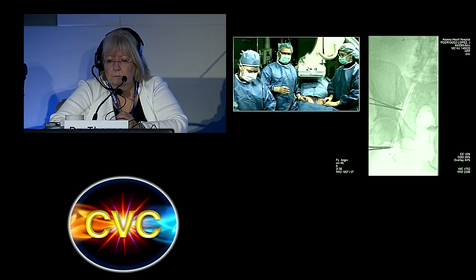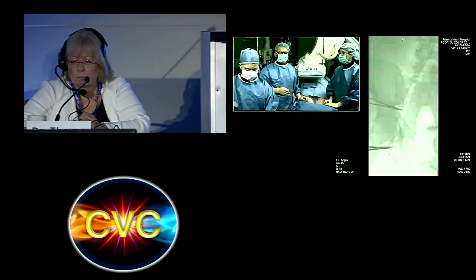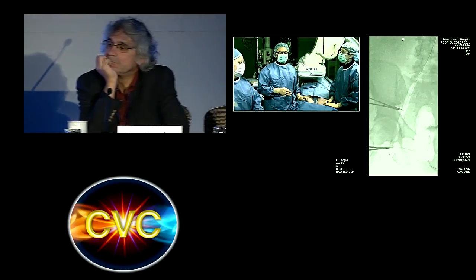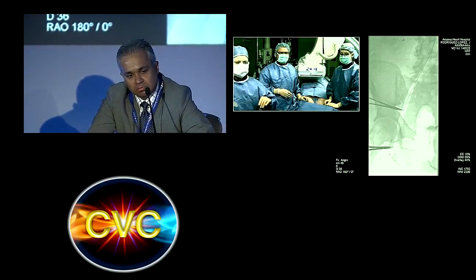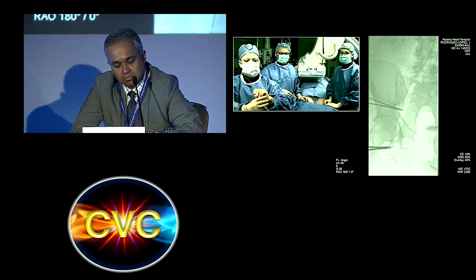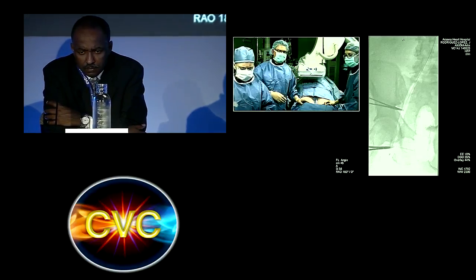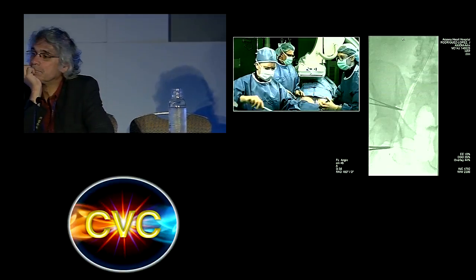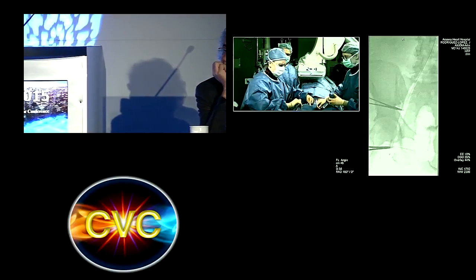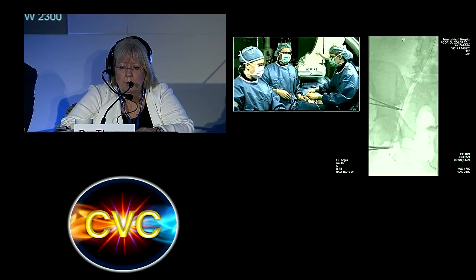One thing about the duplex is that it highlights or emphasizes the problem of the common iliac, something that we didn't see in either the venogram or the IVUS. Of course, this duplex was done in February. It's already several months past. So if that was thrombotic material or something lingering from the previous DVT, perhaps. Well, today, this common iliac looks very clean. You don't think there's anything that we have to do about that area? No, I was really surprised that it didn't look as narrow as we thought it would.